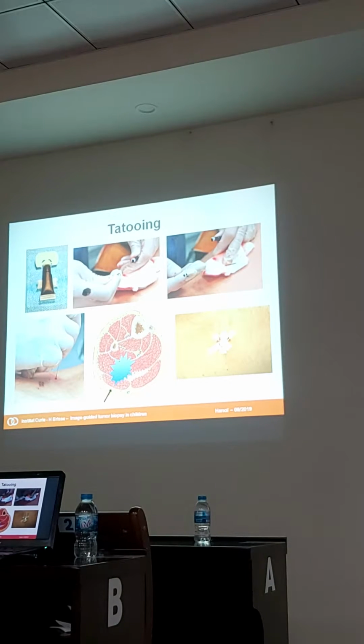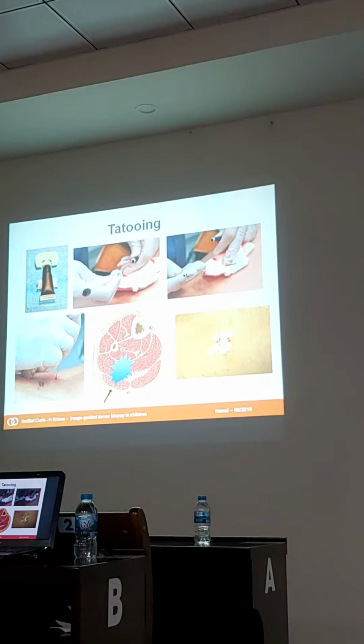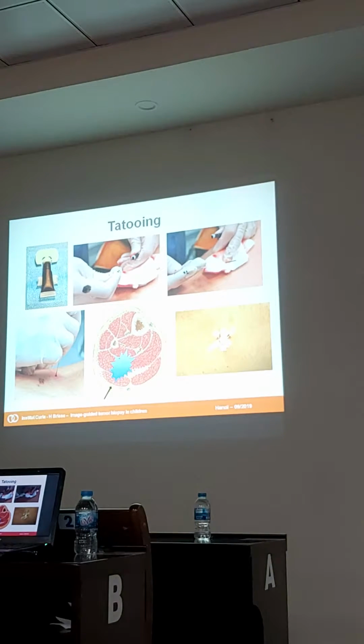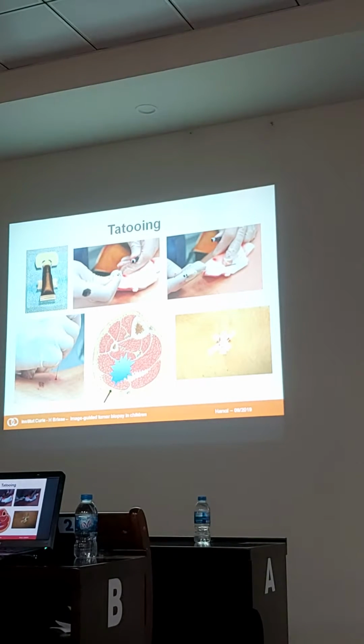The problem is that in children, many sarcomas are first treated by neoadjuvant chemotherapy. So you perform the biopsy, you have the diagnosis, you wait several weeks or even months before surgery when the tumor shrinks with chemotherapy, and then the child is operated, and the surgeon asks, where is the needle tract?